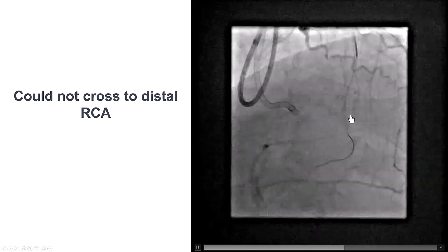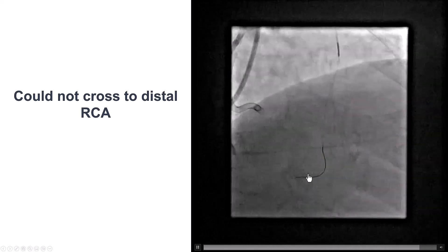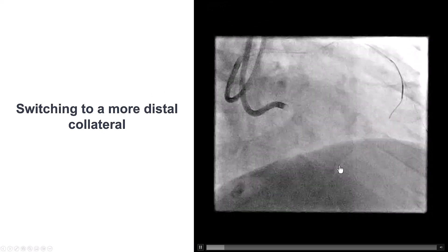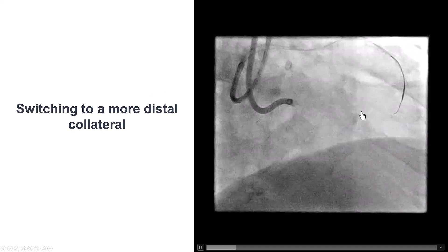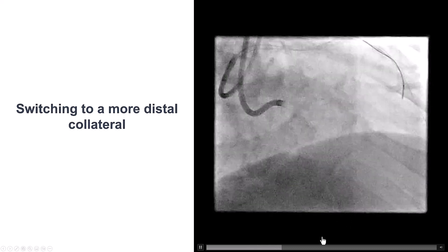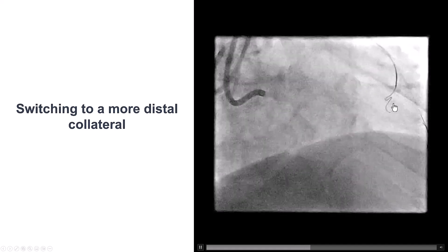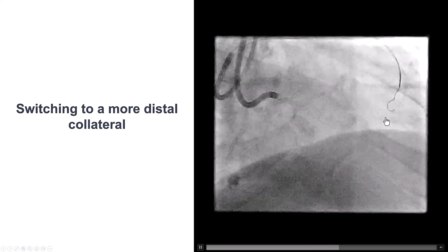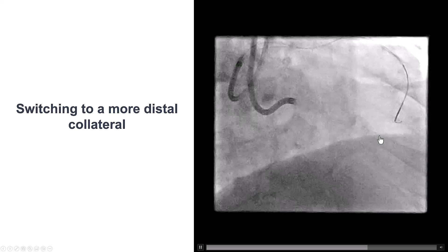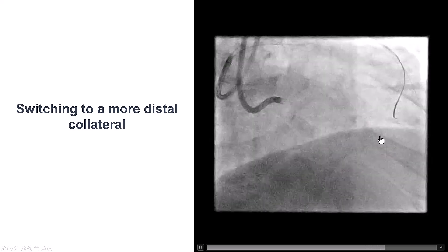That's confirmed on injection — we made it a little bit, but we were clearly above the posterior descending artery. After trying several times, we decided to try a different collateral. We moved to a more distal septal and performed surfing with polymer-jacketed wires as well as a SUO3. Crossing septal collaterals is not uncommon to be difficult; the goal is to keep changing pathways, pulling back, and redirecting until we find the actual collateral location.